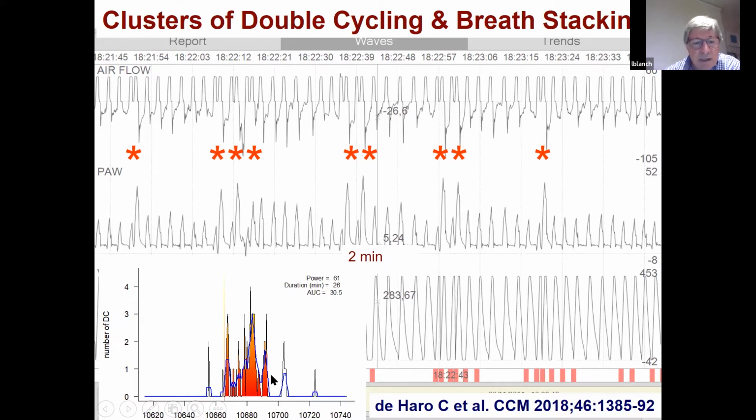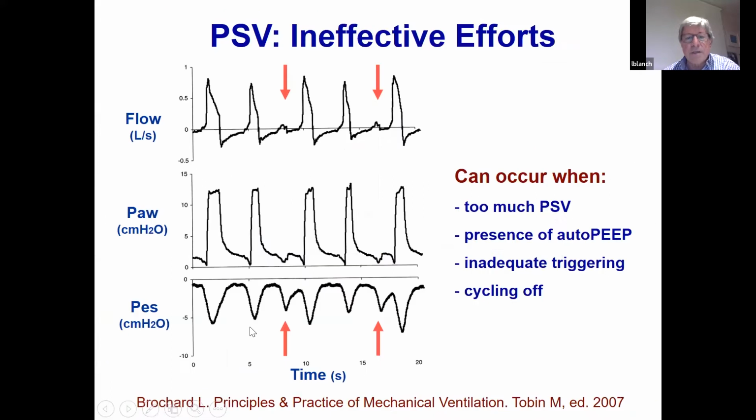And this happens mainly during that period of time, which is during these 26 minutes, for whatever reason, because the patient was more awake, had delirium, has pain, or whatever. I will show later on that this is clearly deleterious for the patient.